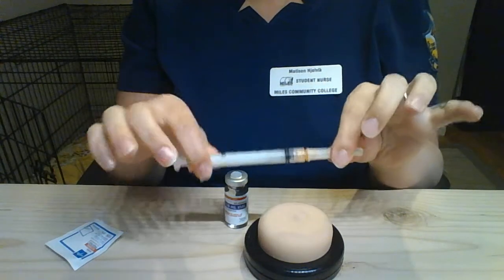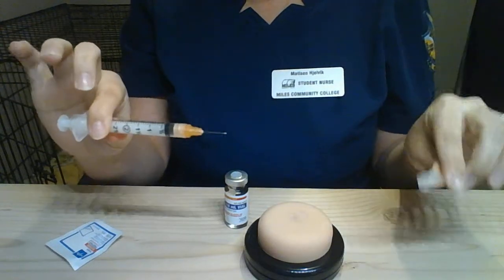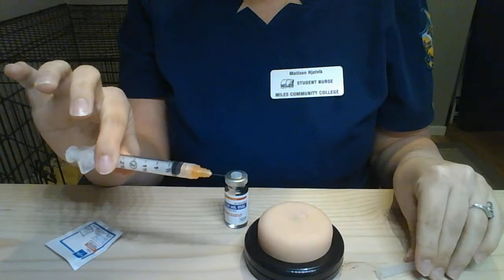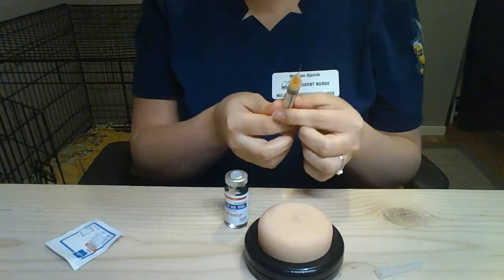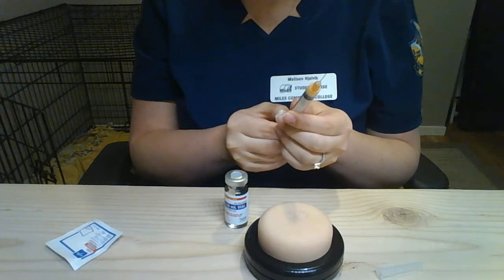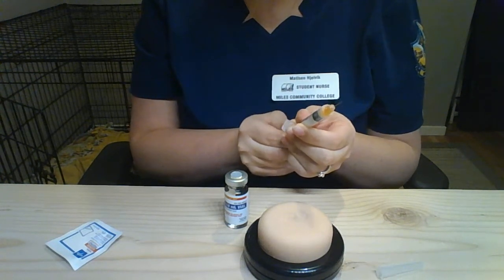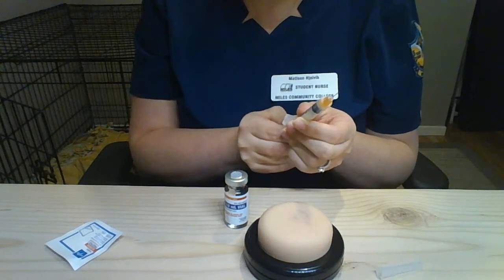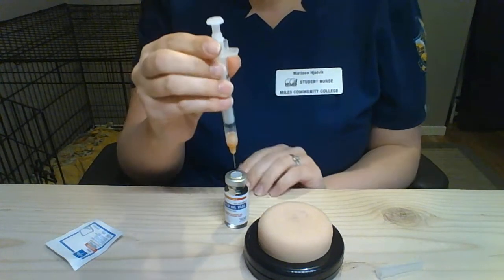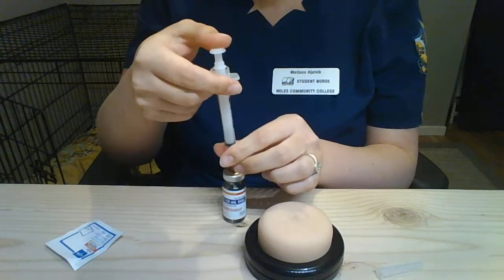Okay, I'm going to remove the cap carefully, pulling away from my body and placing the cap on a clean surface. And then I'm going to draw up the 0.5 milliliters of air into the syringe. So I got 0.5, and insert the tip of my needle in. Insert the air.